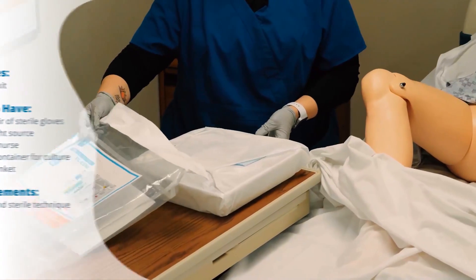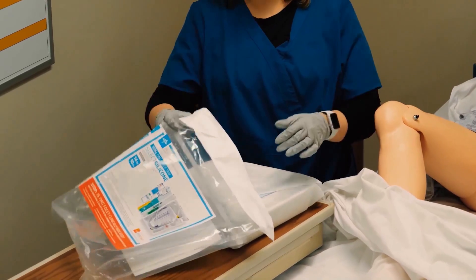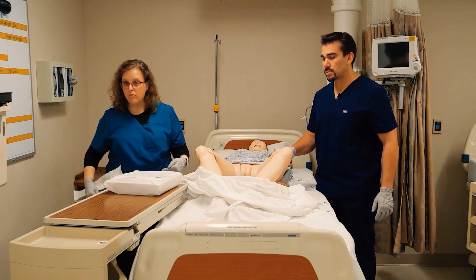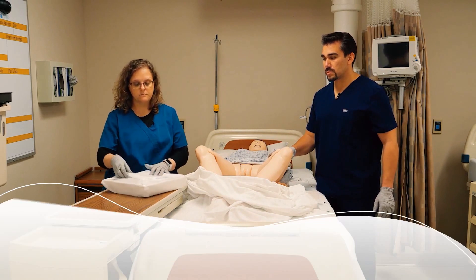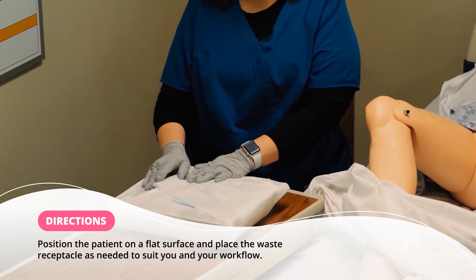Everybody does this a little differently, but as long as you're maintaining sterile technique, there are lots of different ways to do this. Some people will fold the packaging at the end of the bed to use as a trash area. I happen to have the trash can right here so it's easy to just drop things in. Once I start to open this, it's important to keep in mind what's clean and what's sterile.